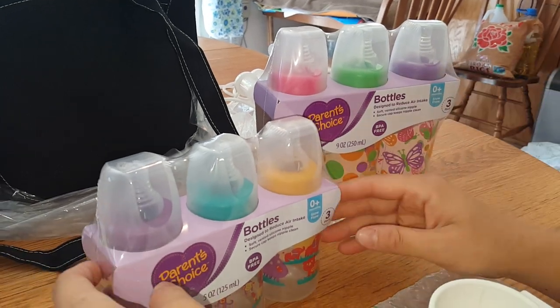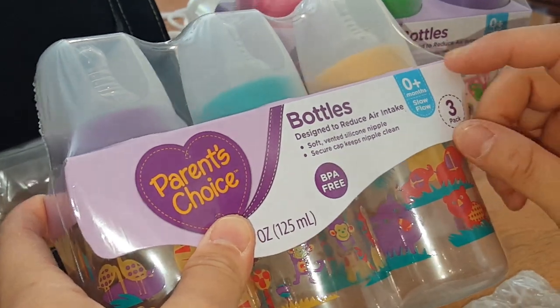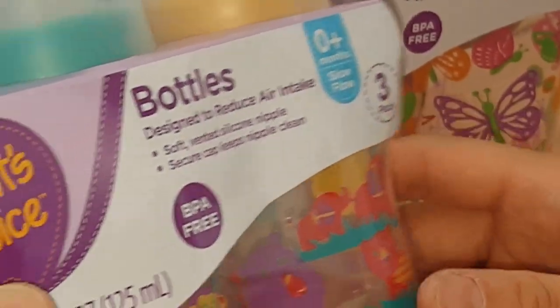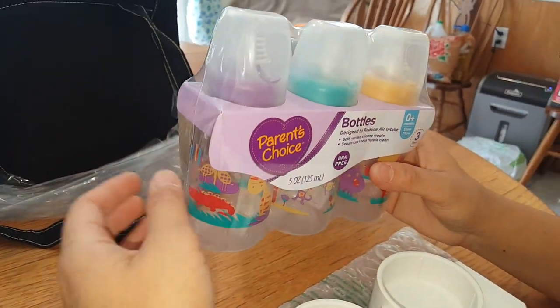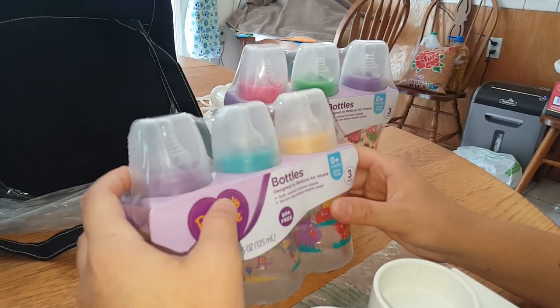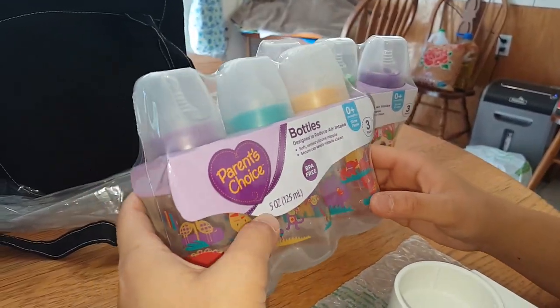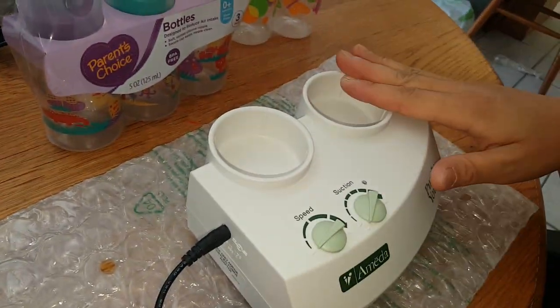The reason I like these bottles is they are BPA free. I always get the slow flow nipples because I found that if you start with slow flow and then go too fast, sometimes it throws the baby off — so that's just what I've learned with experience. I like these because they fit in the Amida pump slot.